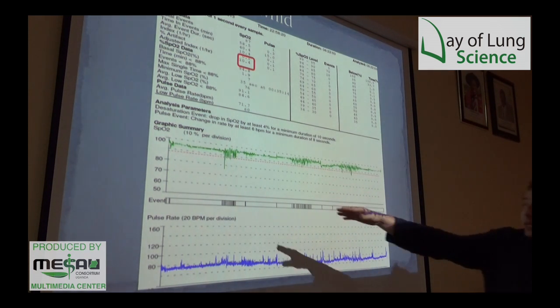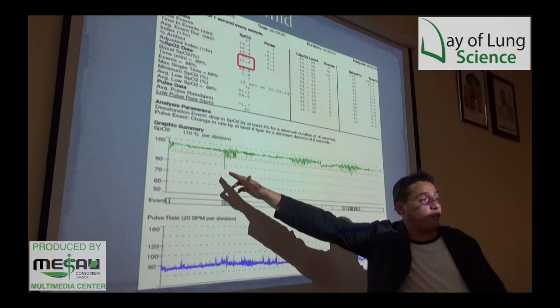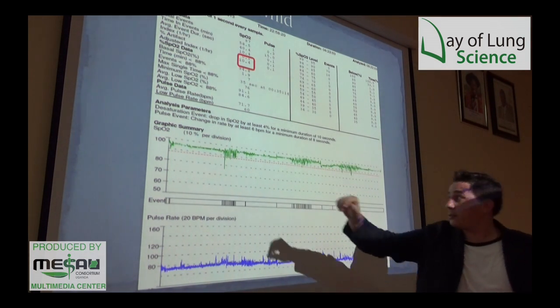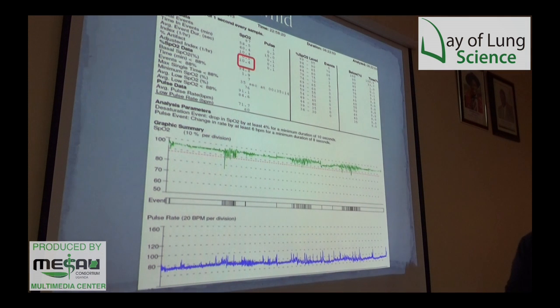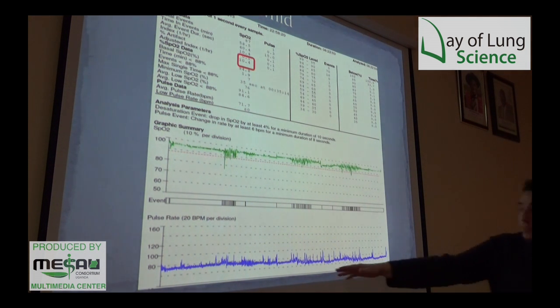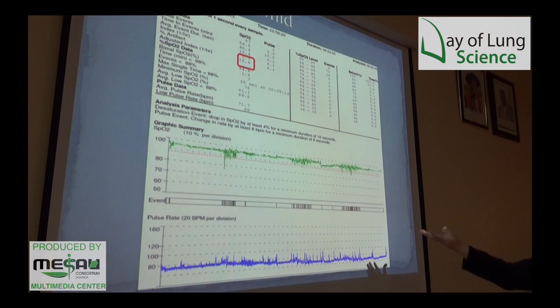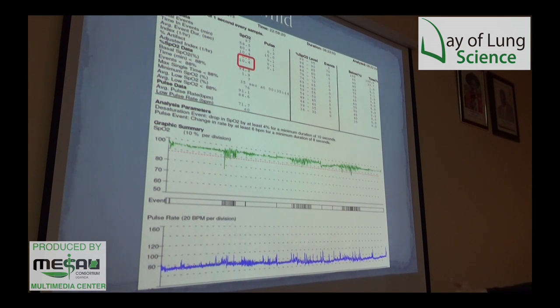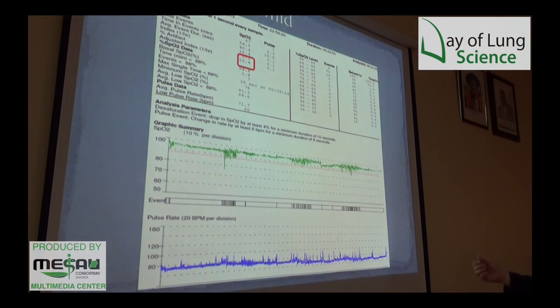You can have quite sharp desaturations depending on the duration of the event. The pulse also starts to become more spiky — that's cardiovascular stress.